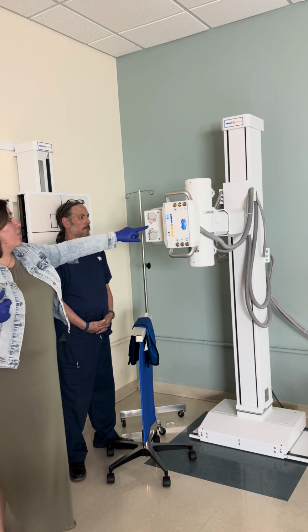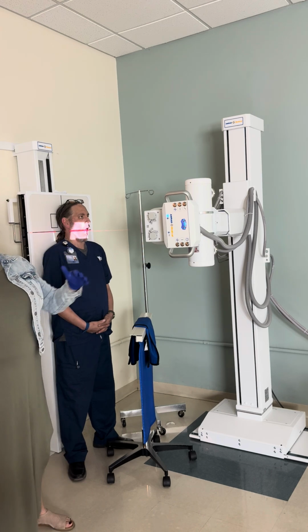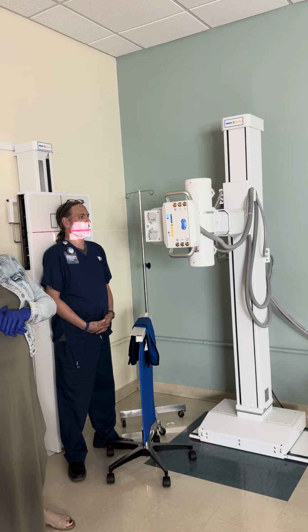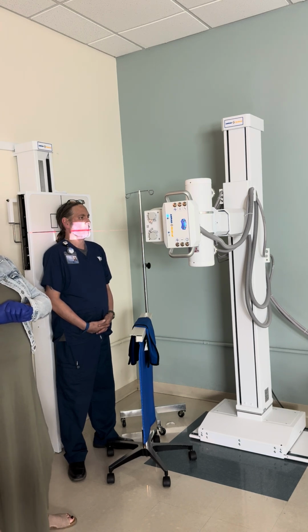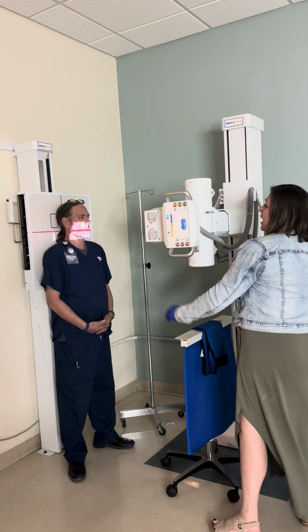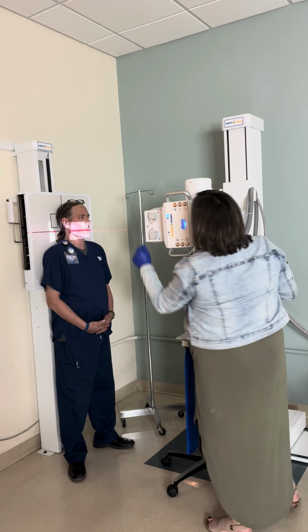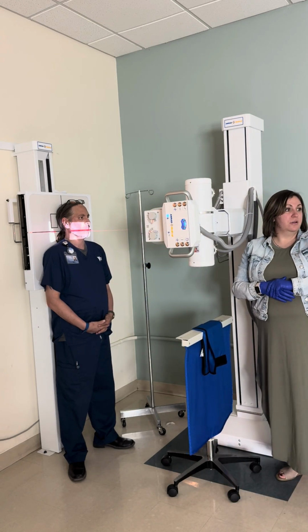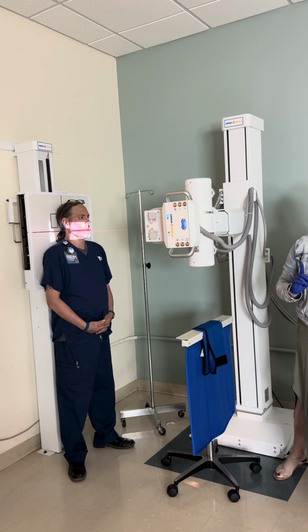So when he opens his mouth all the way, I'm centered there in the middle of his mouth. The ah helps bring the tongue down so that it's out of the way of superimposing over the odontoid process as well. Okay, makes sense? And then my marker is just out on the outer side, so I can open this side to side a little bit more. And I have my marker on the left side of his head there. Okay? So questions about those two?